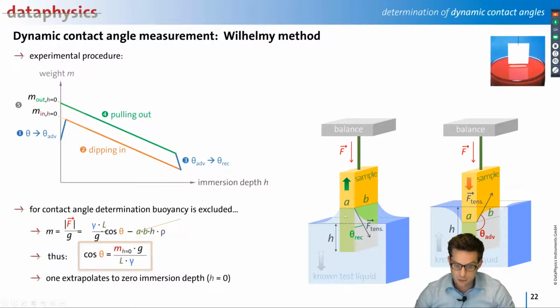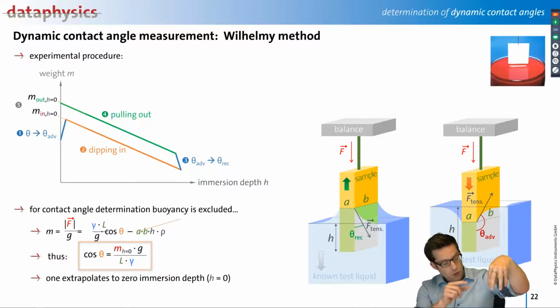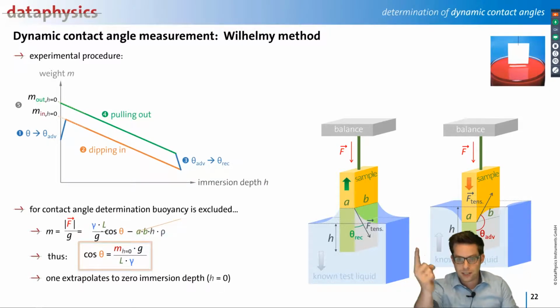So you see in this equation goes in the so-called wetted length. So the wetted length is just how long is the lamella around your substrate. And you can imagine for a tooth implant, it's not the same in every position, because you know the implant, it's a little bit conical. So this means the conical shape has one influence, and also it has the turnings of the screw. So this means if you go up in the position, then this wetted length will change.